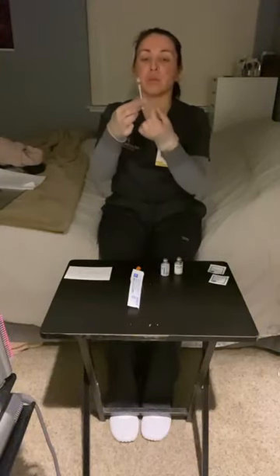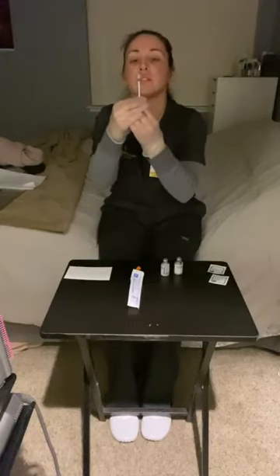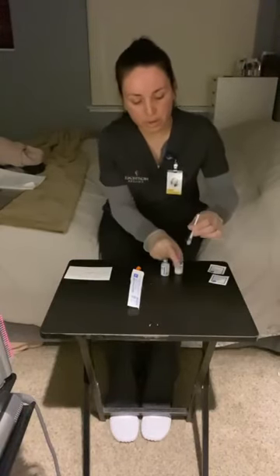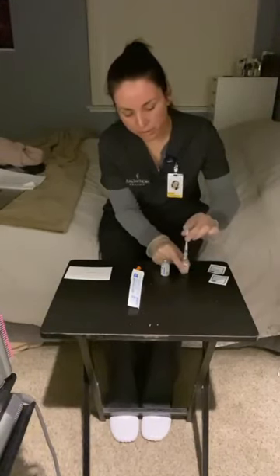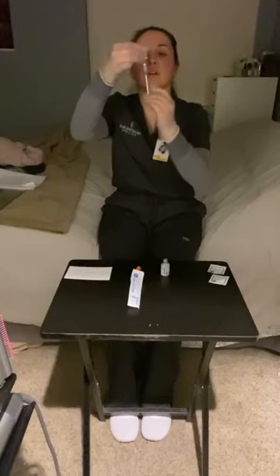I'm now going to pull back on the plunger to the amount of the 4 units for the short-acting insulin. I'm going to put it now into the short-acting regular insulin. I'm going to inject the air into that vial. I'm going to turn it upside down and go ahead and draw up, get the total of 4.